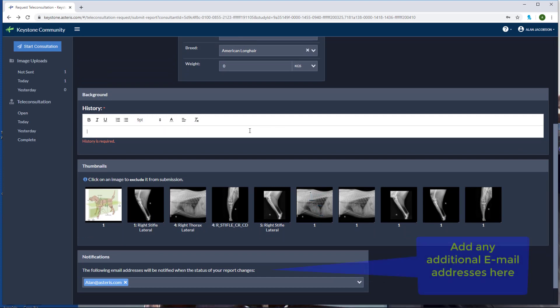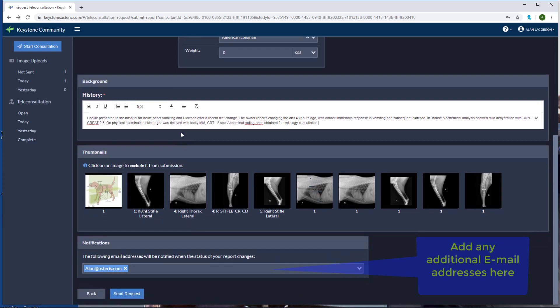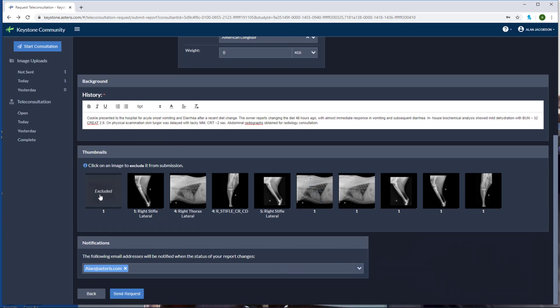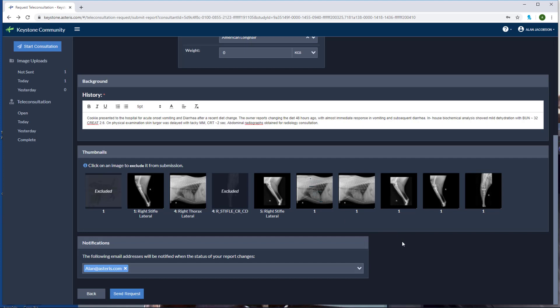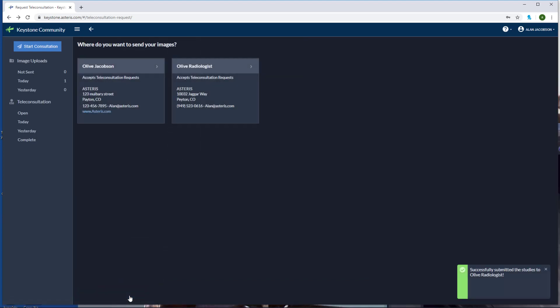Scrolling down you can enter in the patient's history and any notes that you have for the specialist. I've copied an excerpt from cookie's file and I'll just paste it in the history section. Below the history you can see we have the thumbnail view of our images. If there's any images you'd like to not send to the consultant, simply click exclude and the images will not go with the consultation. Now if you're happy with your consultation report, go ahead and hit send request. Now our consultation report has been successfully sent to all of radiology group.